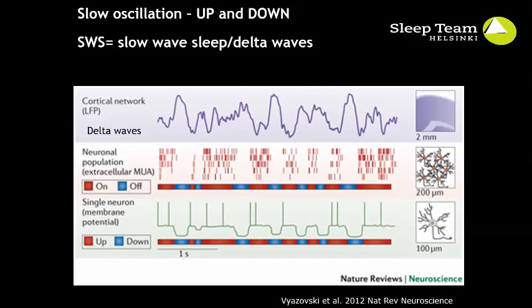At the level of neuronal networks in the sleeping brain, the down states are synchronized so that all neurons reach the down state simultaneously. The synchronized activity is summated to a large amplitude wave in the EEG recording, which is the slow wave or delta wave.